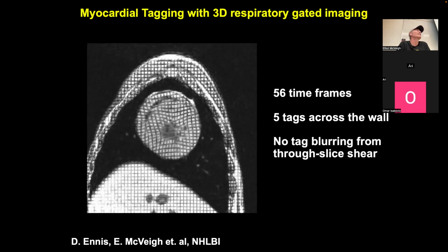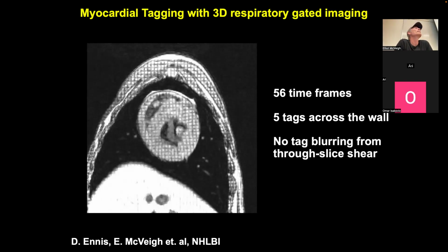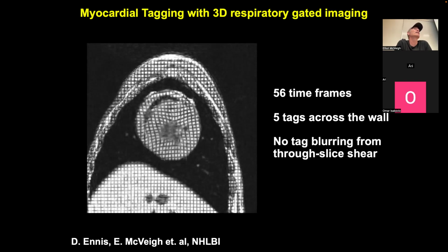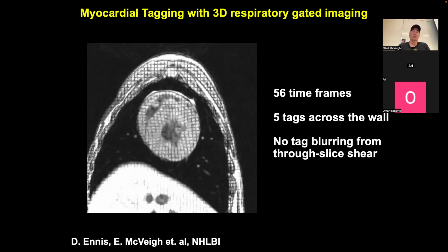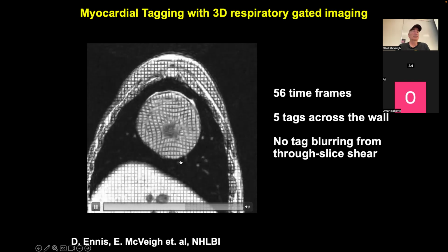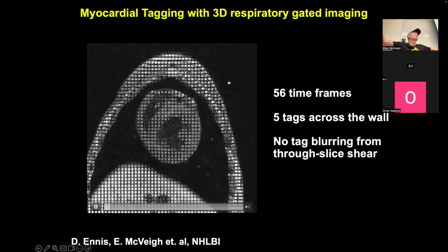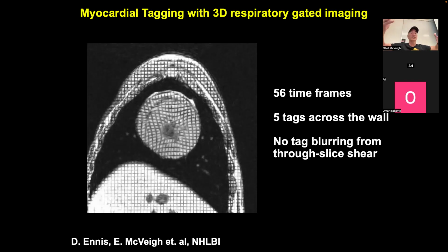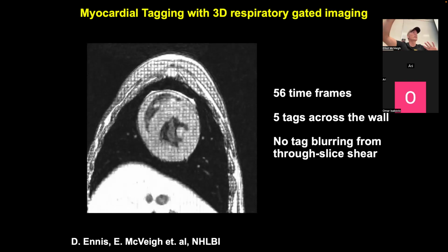Yeah, question. Yes, RF excitation and gradient. So it's like if I was to excite parallel slices down here, right? That's what's happening. It turns out the way you do this efficiently is you do one RF excitation, say on the whole field of view.